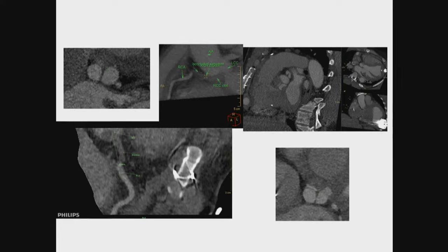And the patient received thrombolytic with some resolution. You can see, not complete resolution, but some resolution. As far as I can recall, we have two cases similar to this. One is the lady with left main thrombosis, and her presentation was obviously more dramatic. Note that this patient has an LVAD, so they may not present with heart failure symptoms. If they're fully supported, they might not present with heart failure symptoms.